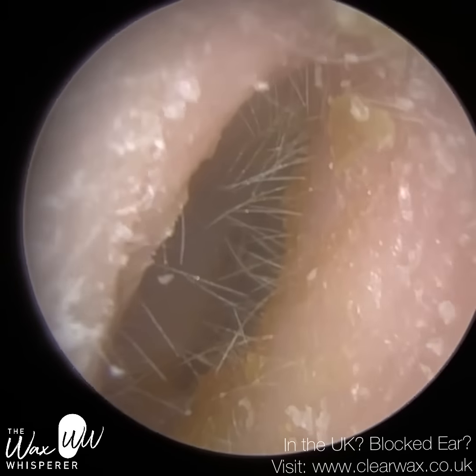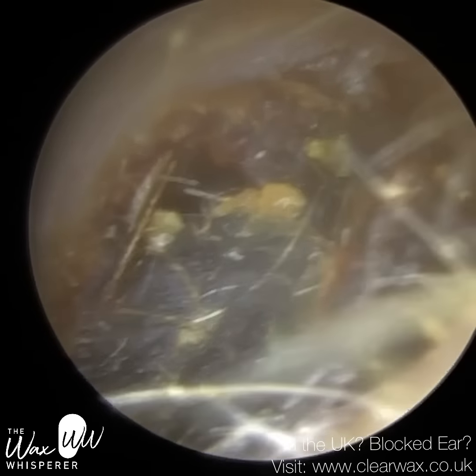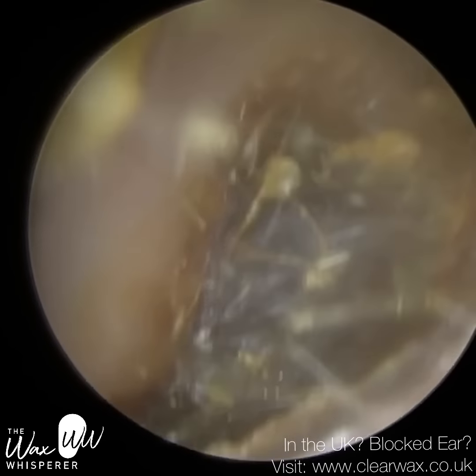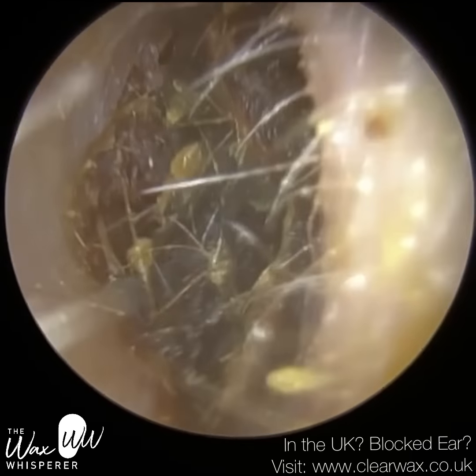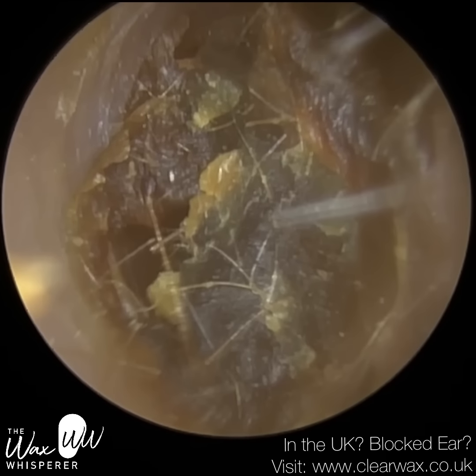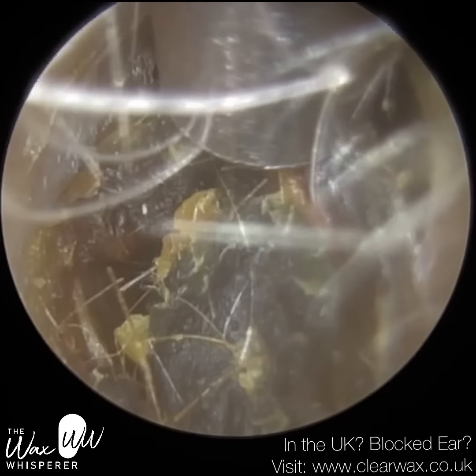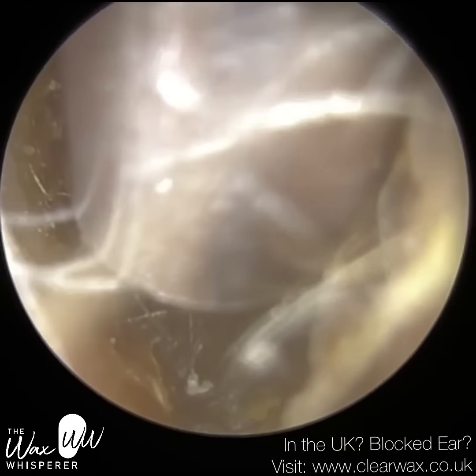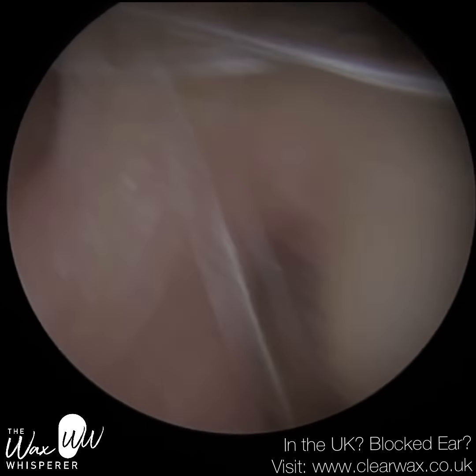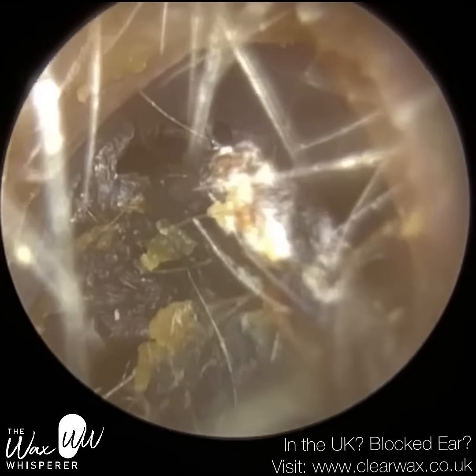So patient 3 has a very narrow ear canal. You can see how narrow it is, and this wax plug is embedded quite deep. You would say it's like two-thirds into the ear canal, so we're well into the bony part of the ear. I'm just using the endoscope to stretch the ear canal open. Again, I initially went in with the suction probe. It's just too dry. I'm not going to get a grip here. I'll be there for a while trying to remove that, possibly unsuccessfully as well.